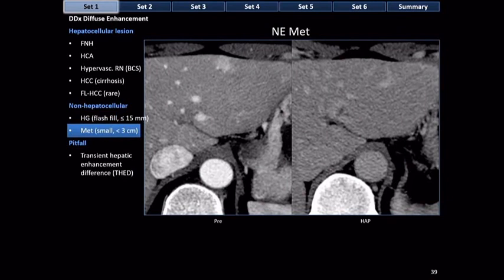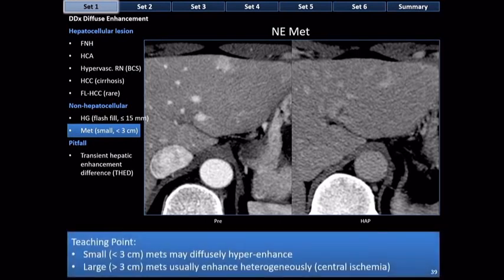Small metastases can be homogeneous because they're not big enough to be necrotic or ischemic. This is an example of a homogeneously enhancing small metastasis — hyperenhancing in the arterial phase. Teaching point: small metastases may be diffusely enhancing, while large metastases are heterogeneous due to central ischemia.